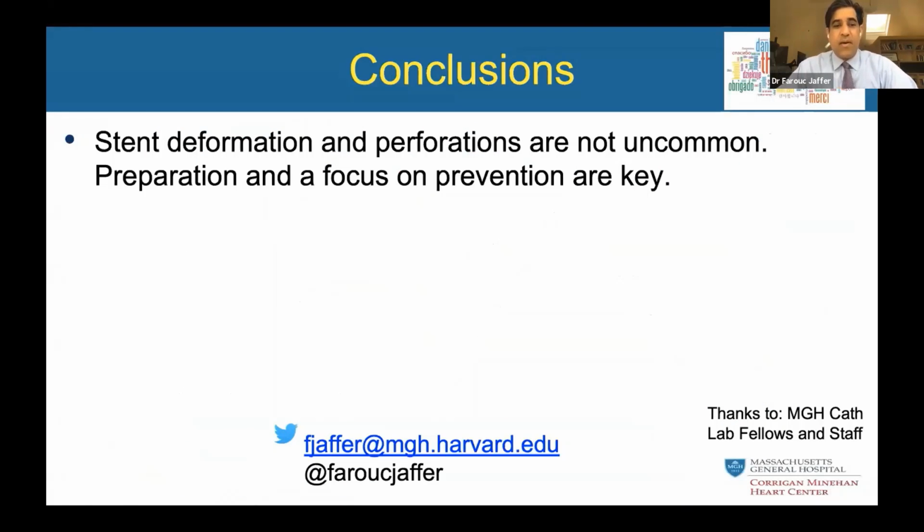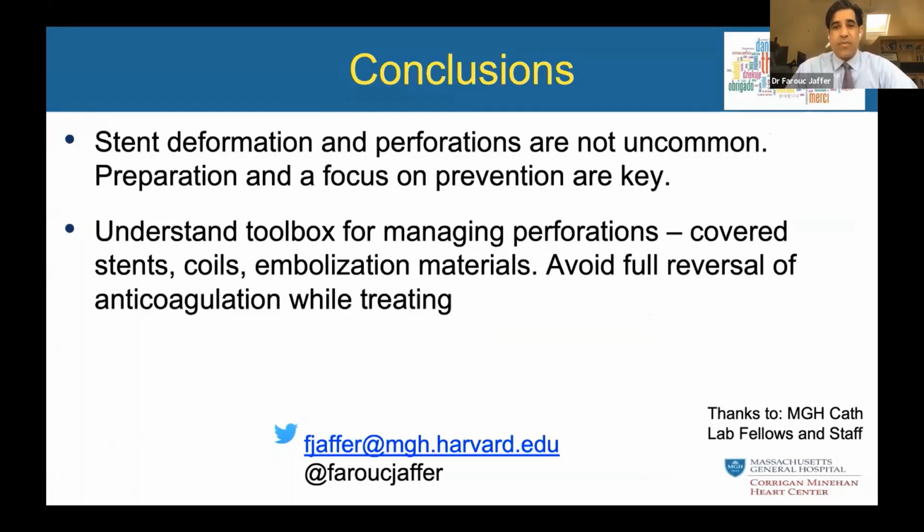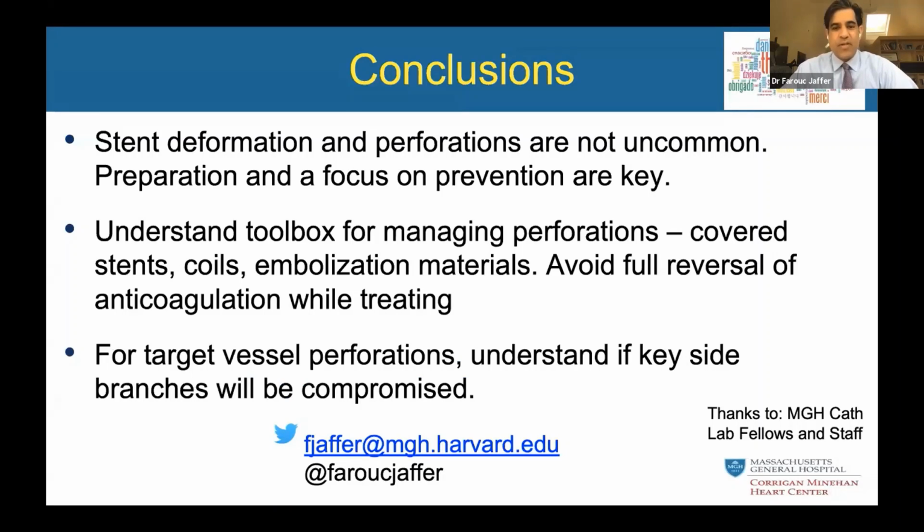So in conclusion, I'd like to just comment that stent deformation and perforations are not uncommon. Preparation, focus and prevention are key. Understanding the toolbox for managing perforations, from covered stents to coils and embolization materials, is critical. Avoid full reversal of anticoagulation while treating. For target vessel perforations, understand if key side branches will be compromised, because one might need to do unusual things like in the last case.